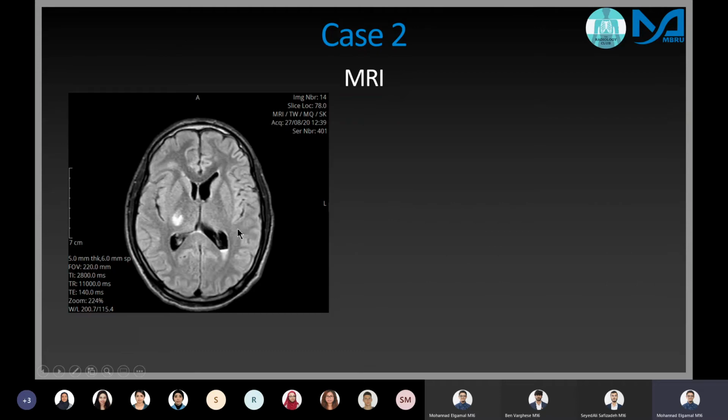So you would do an MRI. So here's an MRI. This is the same lesion we looked at before in the CT. You can see it a lot wider and clearer here, and it's in the right basal ganglia. In the CT it looked like a little bit of blood with edema, but on the MRI it looks like a lot more blood. This was about a few days later, so maybe it was still actively bleeding or clotting or something like that.